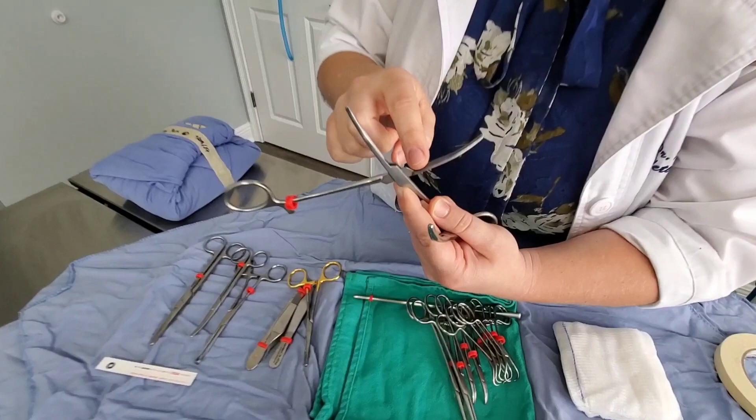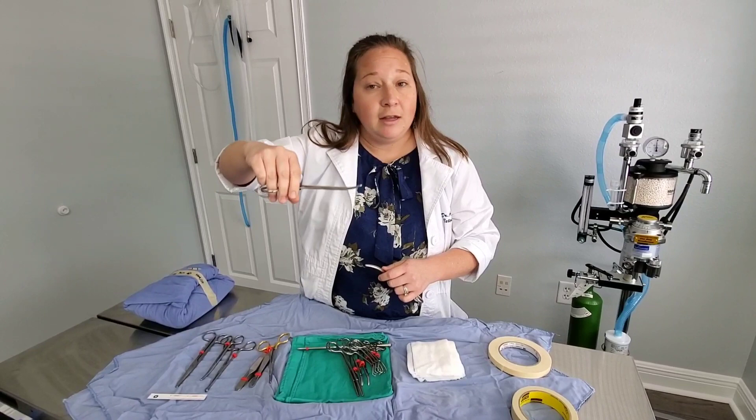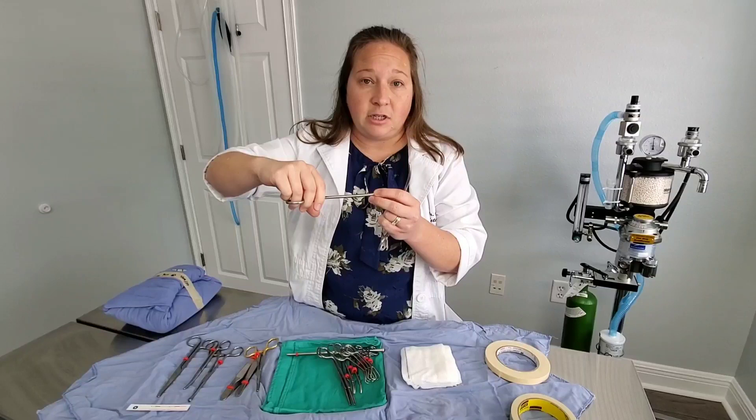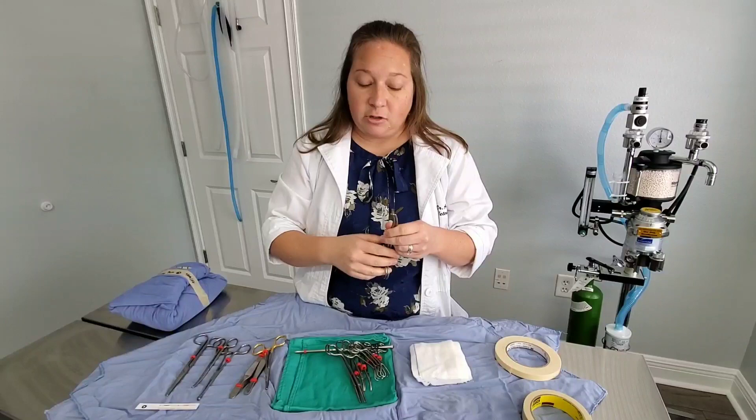Here we have two Carmel clamps. Carmel clamps have some really cool teeth on them — the grooves are longitudinal, going lengthwise on the instrument. When I put this on an artery or some sort of tissue pedicle and clamp down, it applies a crushing force onto those tissues. This helps stop bleeding and crush those tissues. I use these a lot in spays and neuters to stop bleeding — fantastic instruments, really good at what they do.